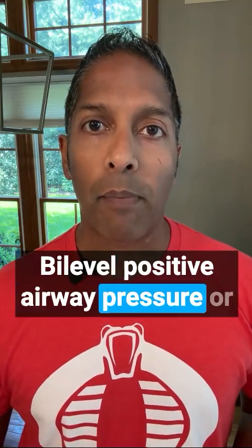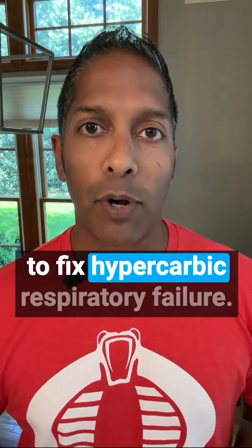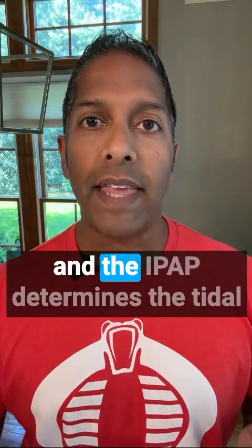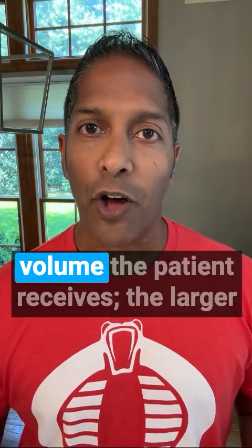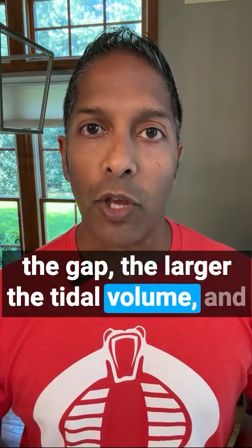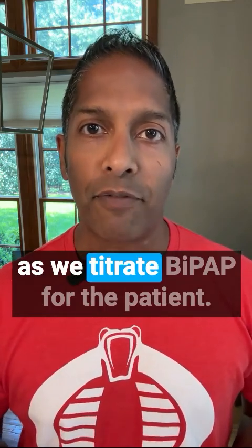Bilevel positive airway pressure, or BiPAP, is the ideal non-invasive mode to fix hypercarbic respiratory failure. In BiPAP, we set both an expiratory and an inspiratory positive airway pressure. The difference between the EPAP and the IPAP determines the tidal volume the patient receives. The larger the gap, the larger the tidal volume. And we have to take all of that into account as we titrate BiPAP for the patient.